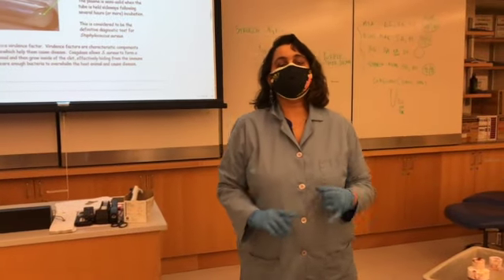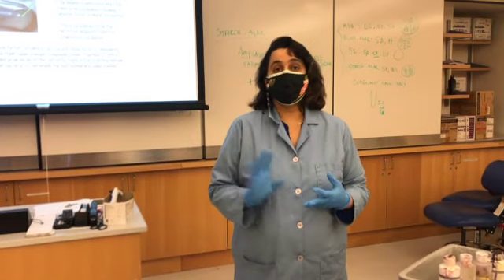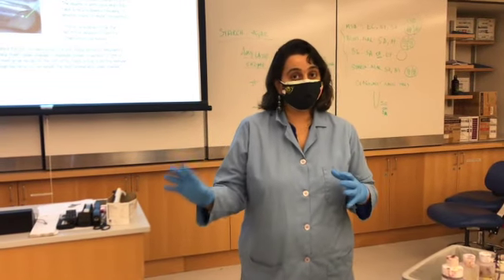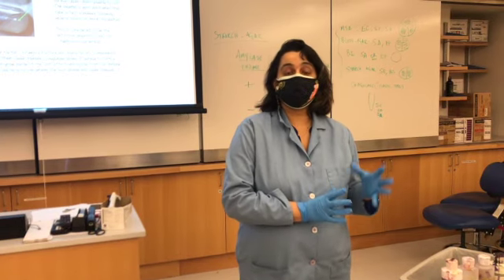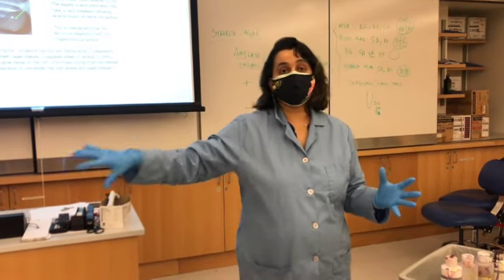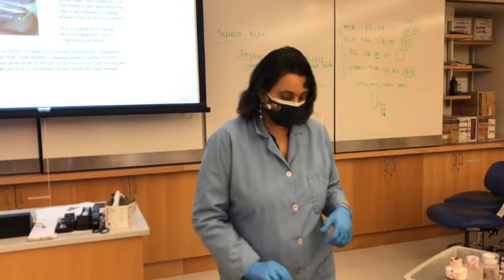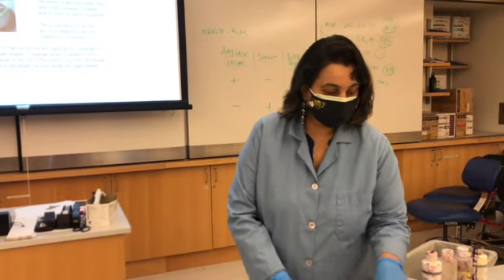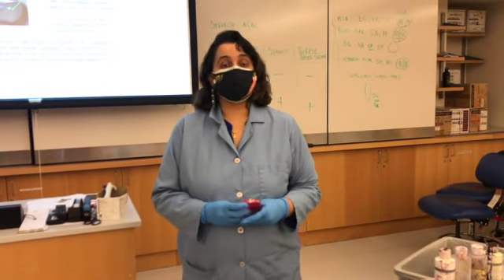So, you learned about the MSA test and the coagulase test. MSA is selective and differential. The coagulase test is a confirmatory test for identifying Staphylococcus aureus against other staph species of bacteria. Then let's learn about another test, which is known as the blood agar test.